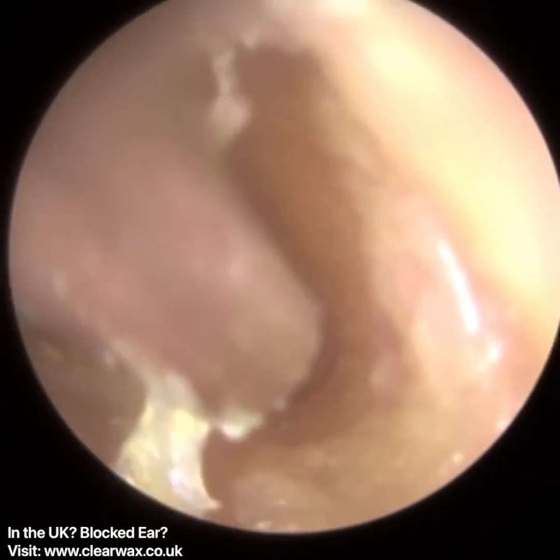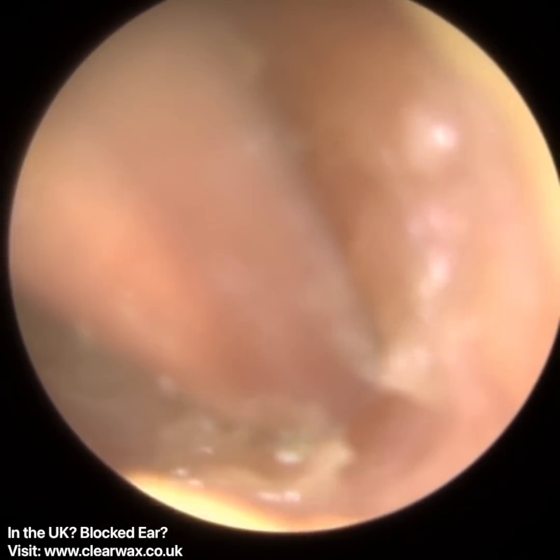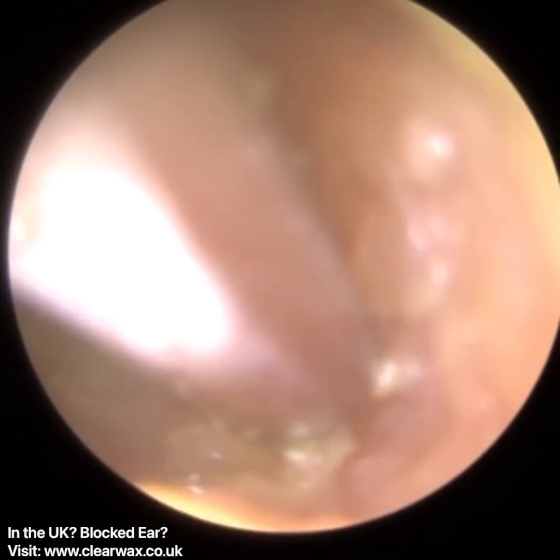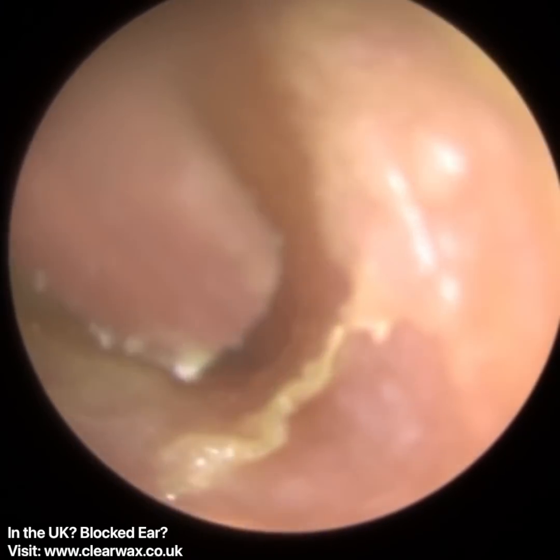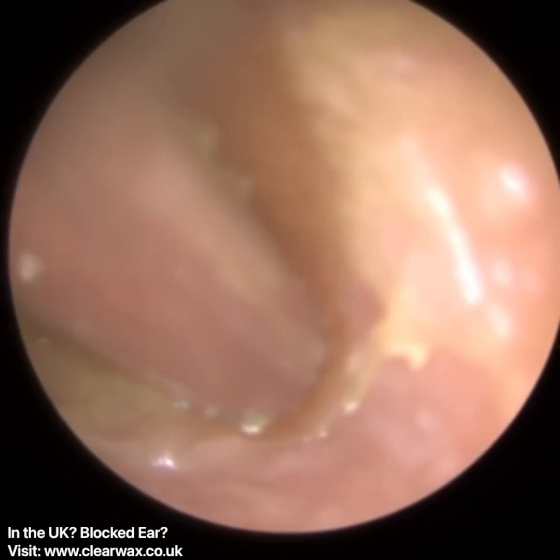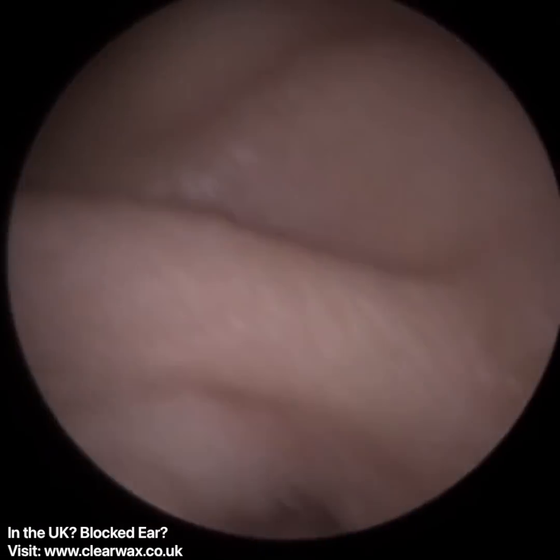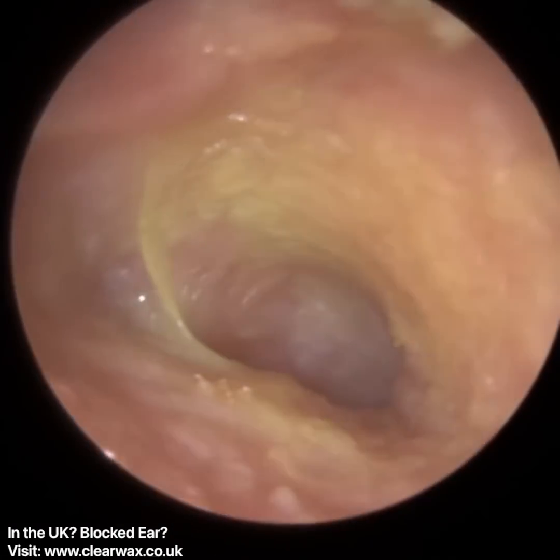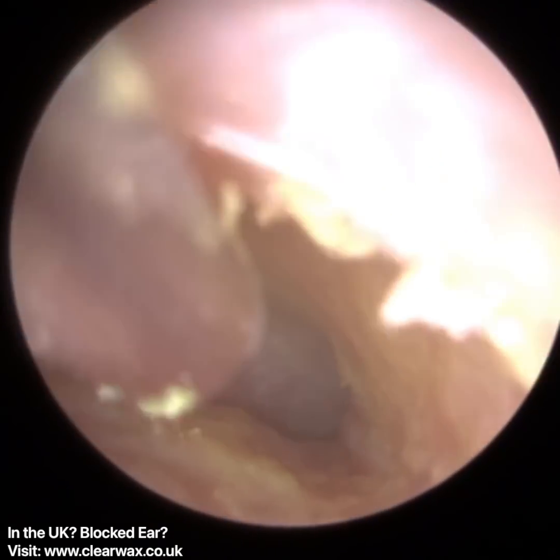The entrance of the ear, you won't have seen it right at the beginning of the video. It's really inflamed, and I couldn't, in the first instance, get the suction probe into the ear because it was so inflamed. Nonetheless, I managed to stretch the patient's ear open, and I'm now using a fine end suction gauge probe, so it's a bit thinner, and I can get access. You can see I'm stretching the ear open, and this is a technique that I train in our earwax courses.